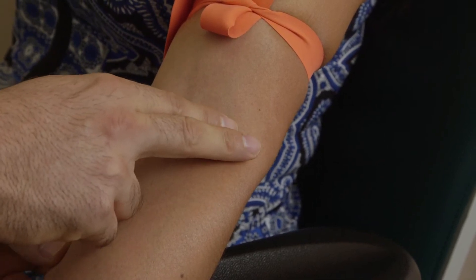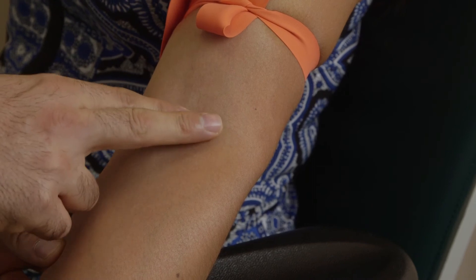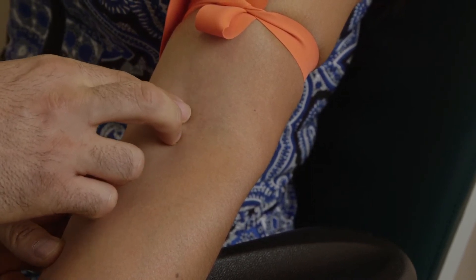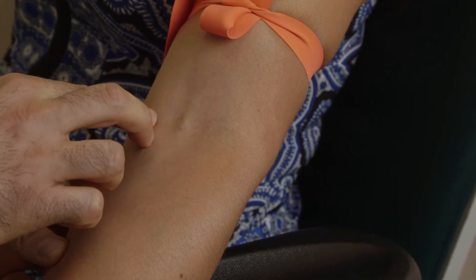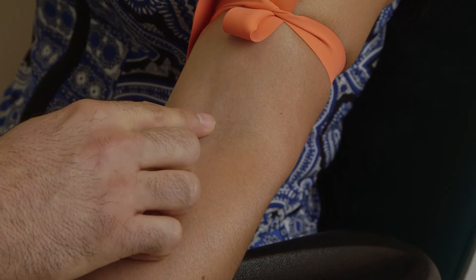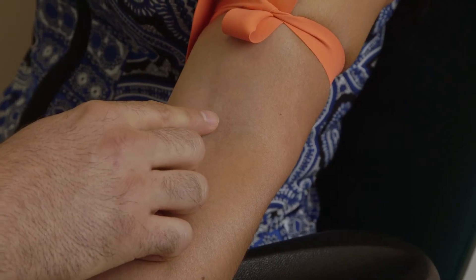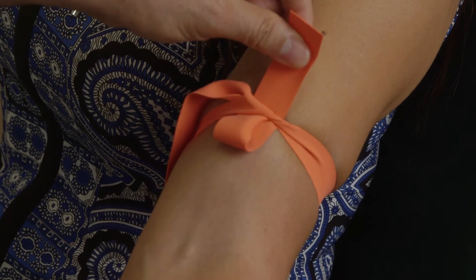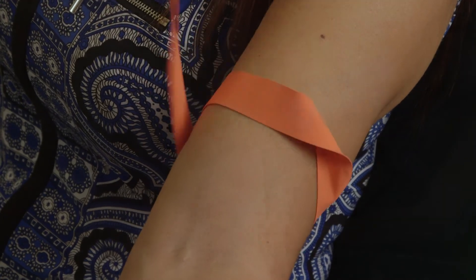I will palpate with my two fingers to feel for the vein, measuring the depth, the width, and the direction in which the vein runs. I have the patient's consent and I am ready to proceed with preparing for the phlebotomy. With one swift motion, I will remove the tourniquet.